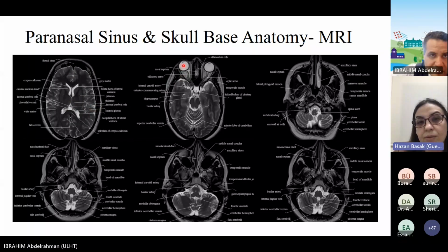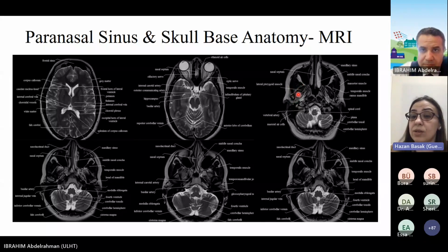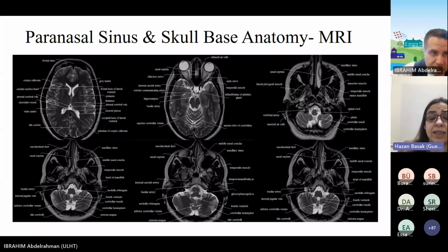The next one will be the eyes. We can see the course of the optic nerve very clearly, and the chiasm very clearly on axial MRI images. And then when we go down, we start to see the pterygoid muscles, temporalis muscles, and masseter muscles much more clearly, which will give us some insights if the sinonasal malignancy is involving the pterygoid muscles, or if it is going inside the masseter muscles or masticator space, etc. It's very important. Far back, we start to see the basilar artery at the posterior cranial fossa, and right in front of that, the clivus, middle part and inferior part of the clivus, and then we start to see the vertebral artery inferior to that. Next one.